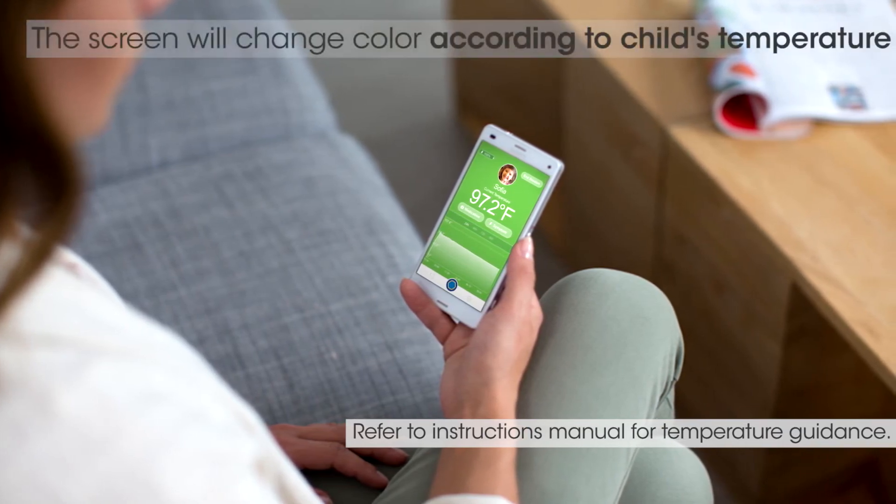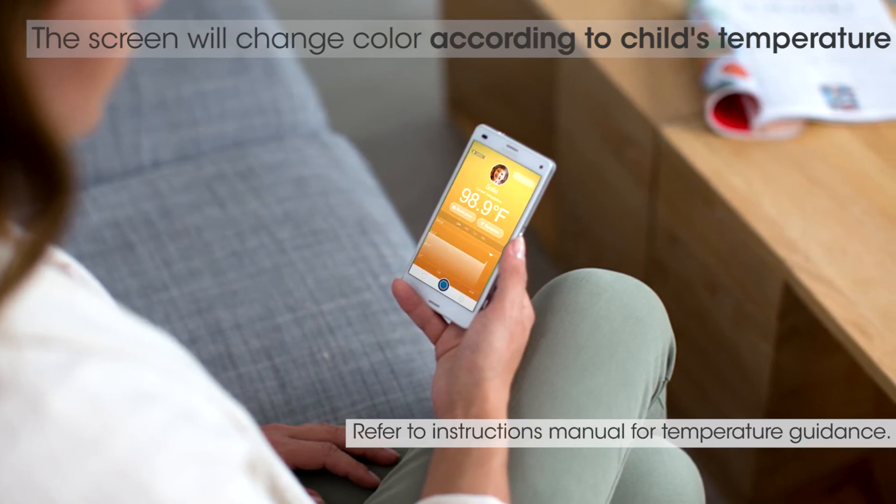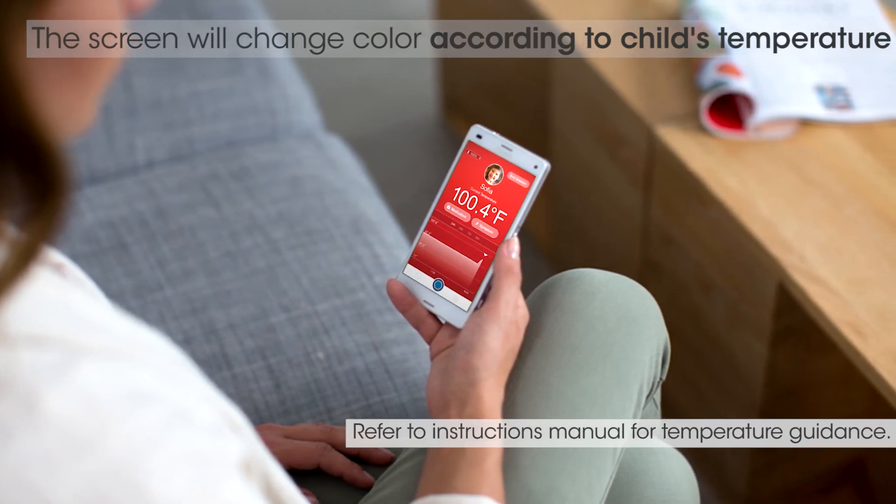The screen will change color to indicate whether their temperature is normal, moderate, or high, based on their age.